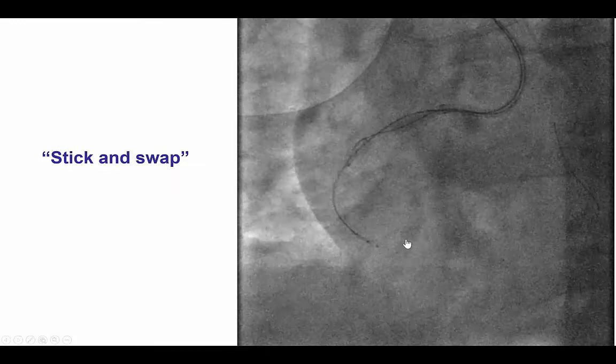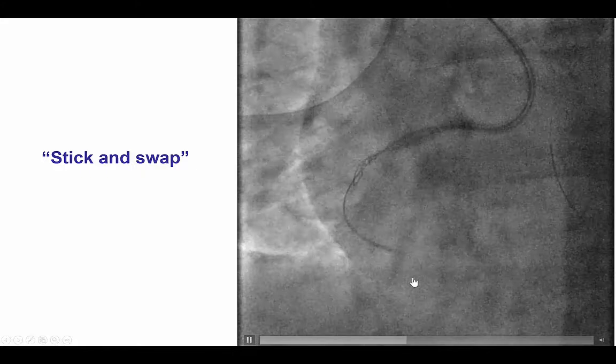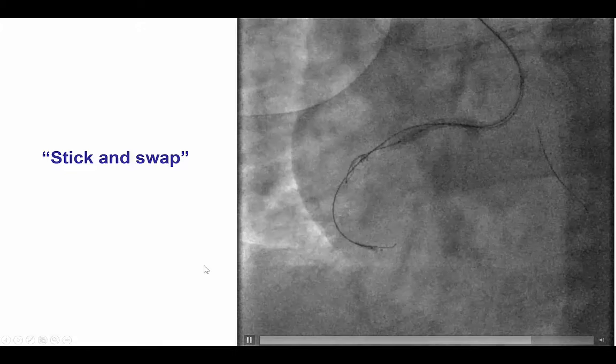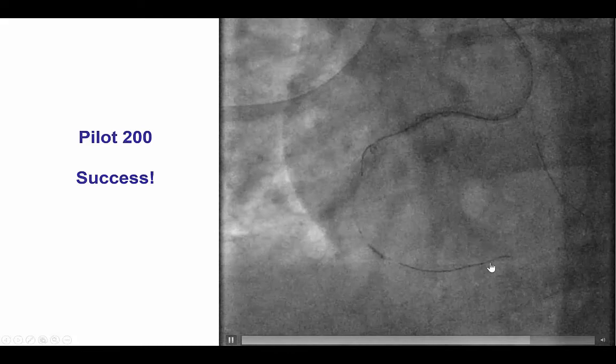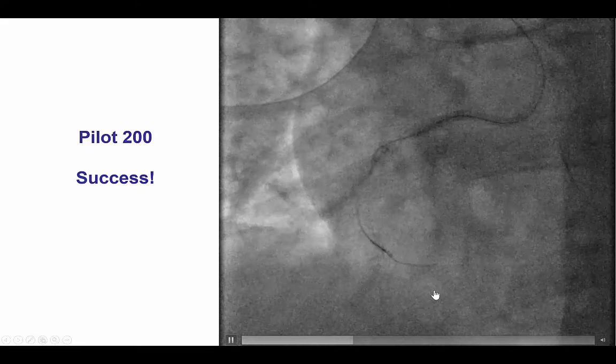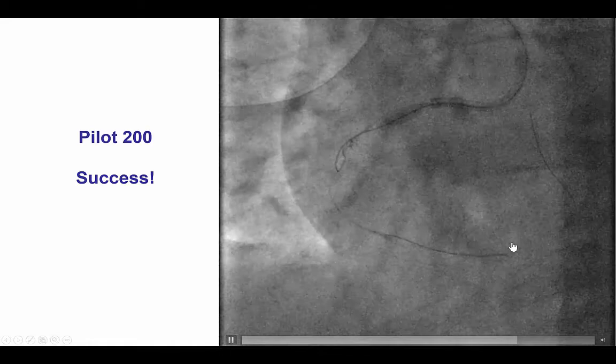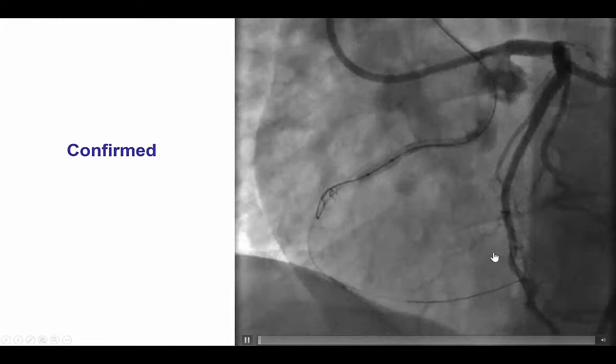Therefore, we advanced the Stingray LP all the way to the distal right coronary artery. We performed the Stick and Swap technique by sticking both inferior proximal to the proximal marker as well as superior between the two markers, and then switching for a Pilot 200 guide wire, which we tried on both ports. After pulling back and redirecting, we achieved nice advancement into the distal true lumen — successful re-entry with a double-blind Stick and Swap technique, in which we puncture on both sides and then switch for the Pilot, which eventually finds its way into the distal vessel.